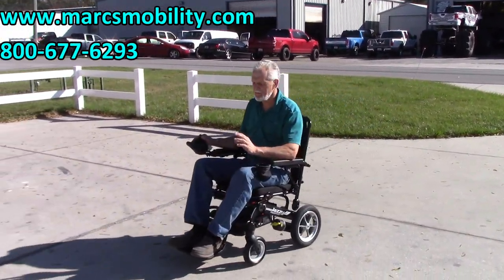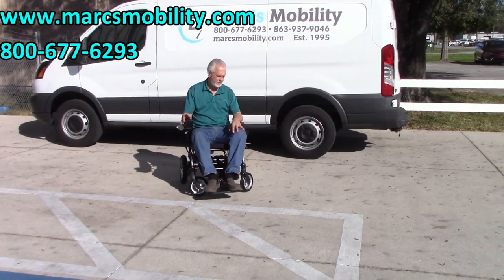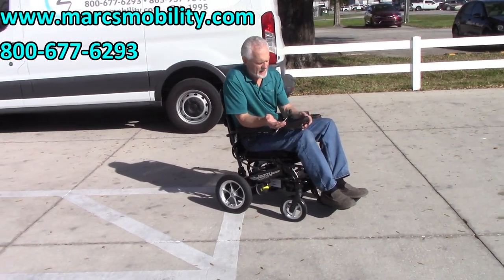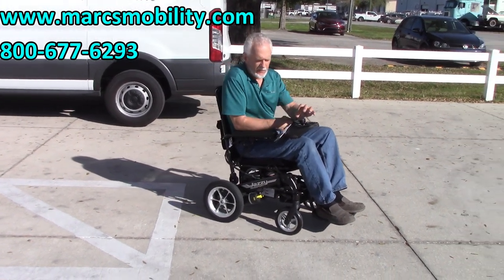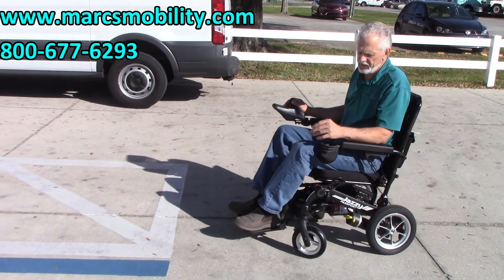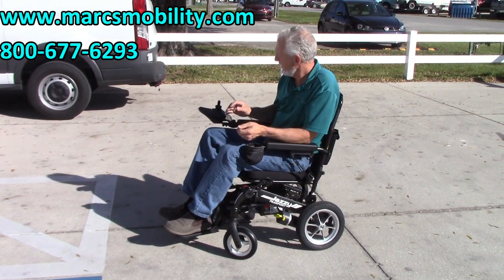It's a very easy chair to drive, very non-responsive in feel — great for new users. You have five speed settings; fifth speed is 3.6 miles an hour, and first speed is very slow. It doesn't respond very fast, making it an easy chair to learn. This is the Jazzy Passport in black, the new version just released a couple months ago, available right now.